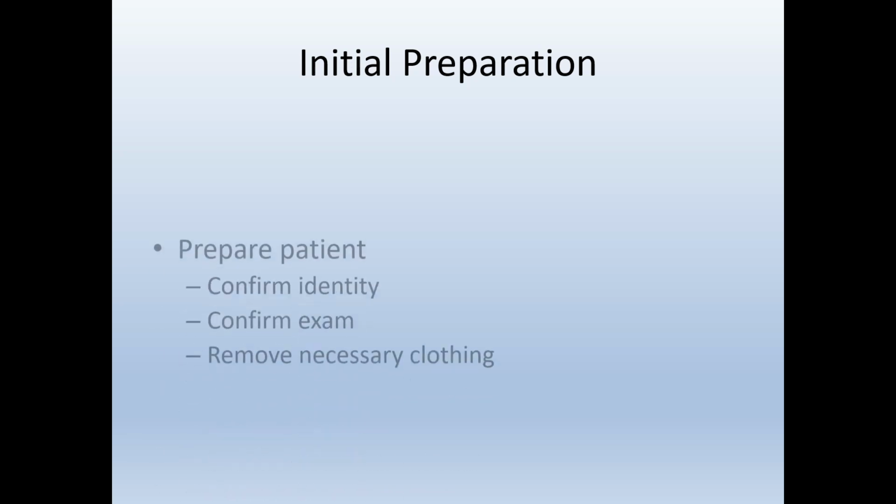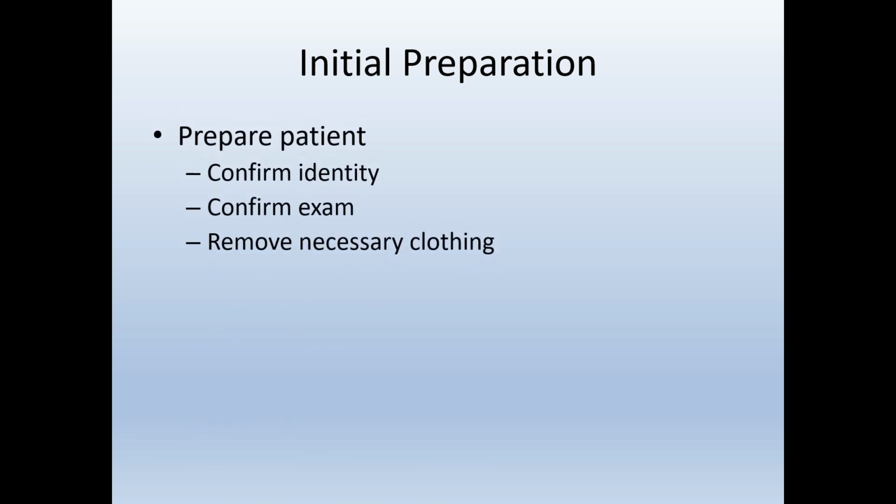Before beginning any exam, preparation of the patient and your equipment is necessary. The steps necessary to prepare are, at minimum, to greet the patient, confirm their identity, and confirm the exam you will perform, and have them remove any clothing that might interfere with the examination.